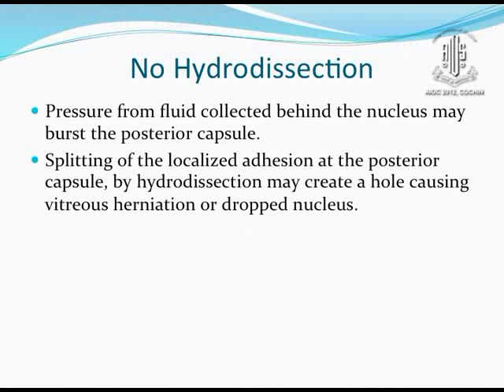No hydrodissection, as the pressure from the fluid collected behind the nucleus may burst open the capsule, and the fluid wave may split the localized adhesion at the posterior capsule, creating a hole which may cause vitreous herniation and nucleus prolapse.